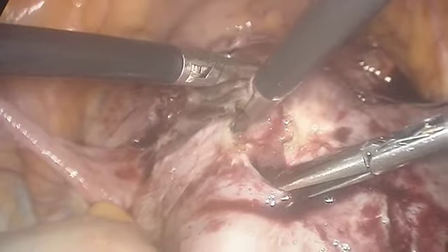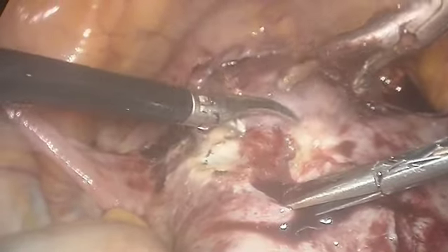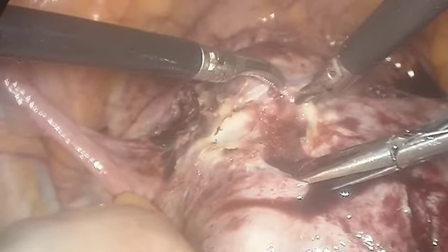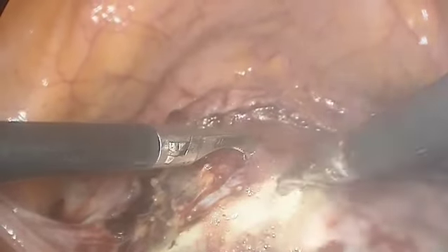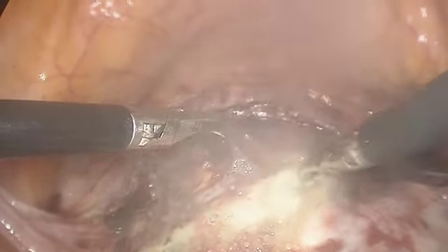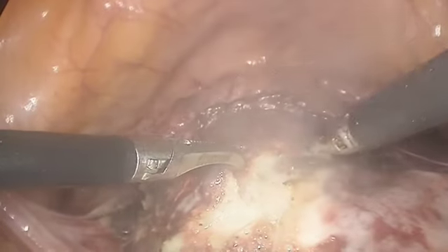Step 5. Now the scar tissue is opened at the junction with healthy myometrium. Once opened, you can see the products of conception within the defect. These are gently aspirated. Notice the importance of distinguishing where normal uterine wall ends and scar tissue begins. This prevents removal of unnecessary healthy muscle.